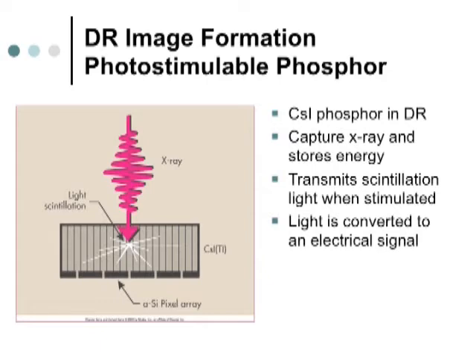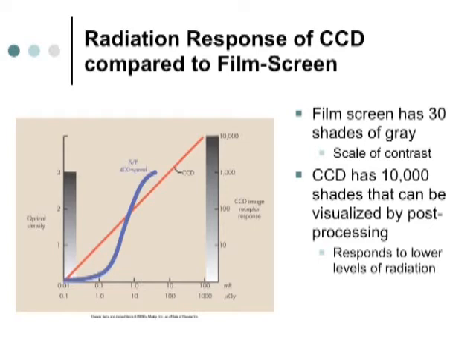Now this is the beauty of digital radiography. CR is a form of digital radiography, and then direct exposure like I just showed you. But here's our old H&D curve, and this is with a 400 speed system. Okay. Now what do we say about this area of the curve? What's wrong with that? The toe of the curve? It's too light. Really, the film is not sensitive in that range, therefore those light areas are undiagnostic.